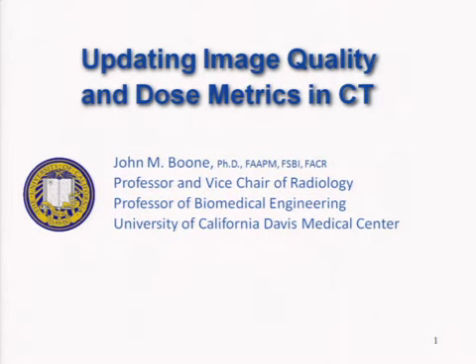I was on NPR last Wednesday, and the person asked me, well, what about all this kind of stuff? And I was talking about millisieverts, and I saw his eyes roll, so of course you always have to couch it in terms of a 3 millisievert annual background dose, or a lot of people use chest X-rays as a unit of dose, but I'm not a big believer in that.